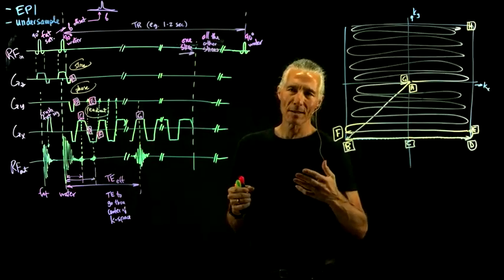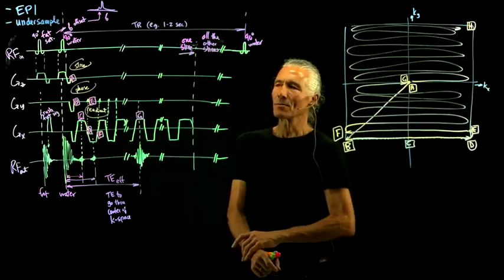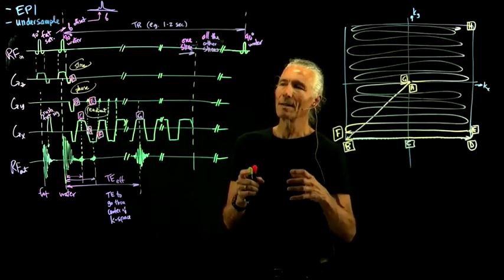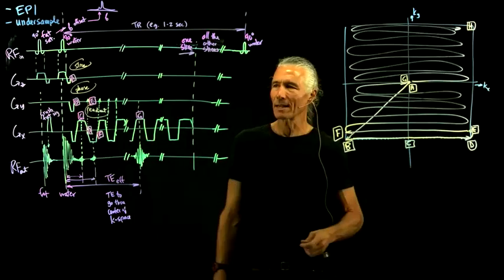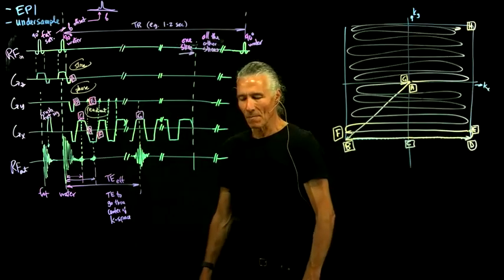That's the only way to do functional MRI, where you're looking at changes over time due to changes in blood oxygenation, which are caused by changes in activity. Those changes are happening second to second, and so we need to be able to record very quickly. So what was the reason?